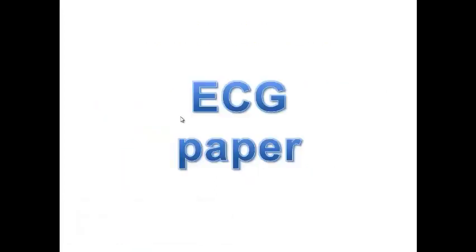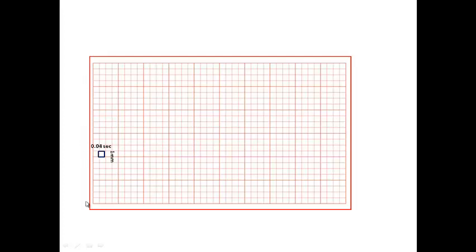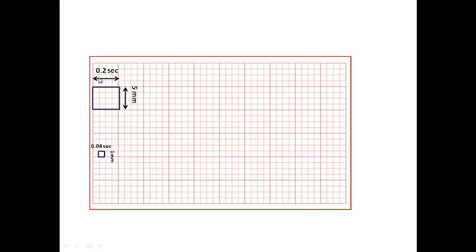The ECG paper is a graph paper with large and small squares. On the vertical axis is voltage or amplitude; on the horizontal axis is time in milliseconds. The small square has a height of 1 mm (voltage) and a width of 0.04 seconds or 40 milliseconds. The large square is five times the small square — height of 5 mm and duration of 0.2 seconds or 200 milliseconds.